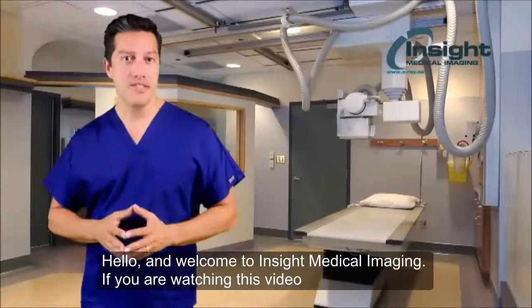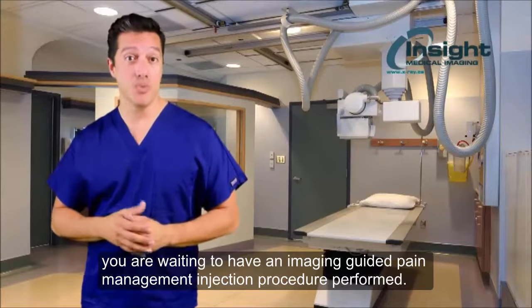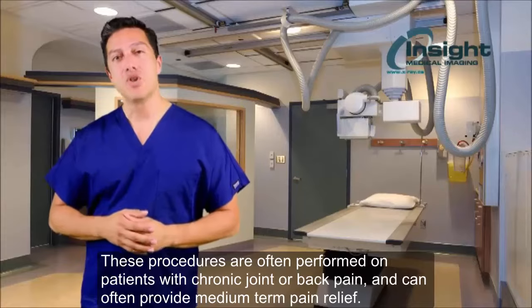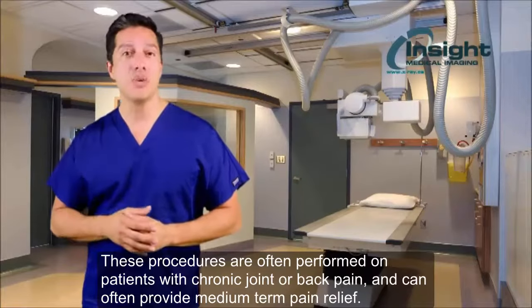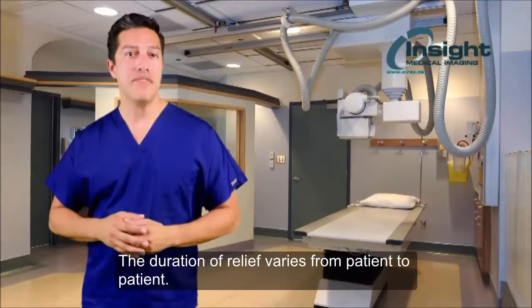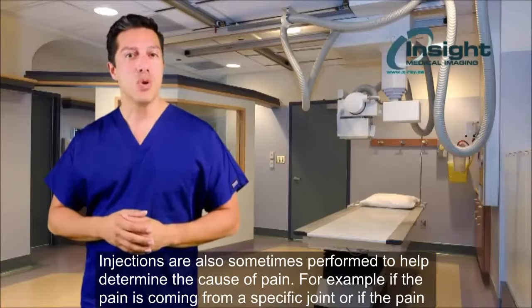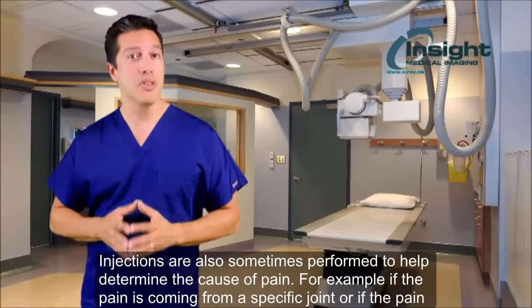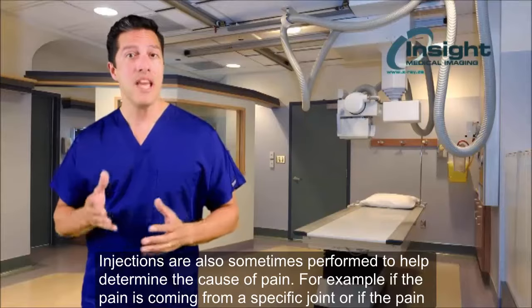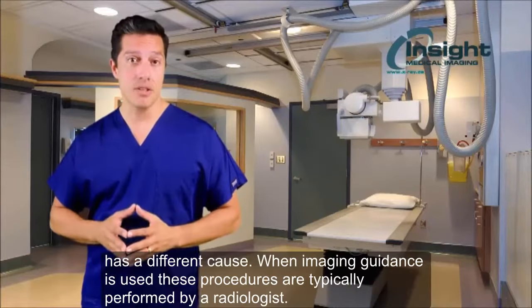If you're watching this video, you're waiting to have an imaging-guided pain management injection procedure performed. These procedures are often performed on patients with chronic joint or back pain and can often provide medium-term pain relief. The duration of relief varies from patient to patient. Injections are also sometimes performed to help determine the cause of pain. For example, if the pain is coming from a specific joint or if the pain has a different cause.